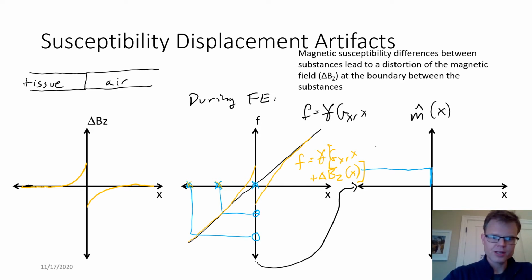Now, far away from the edge here, we'll have the same mapping as we did before. And as we get closer here, again, the same mapping. But now, what's going to happen at the middle point here, right next to the center, is that it's going to be mapped up to this frequency value right here. So when we take our frequency axis, we're going to flip this over and take the different frequencies, convert them into position.